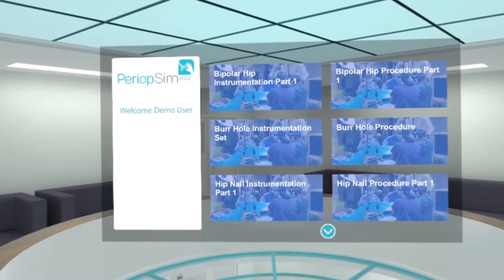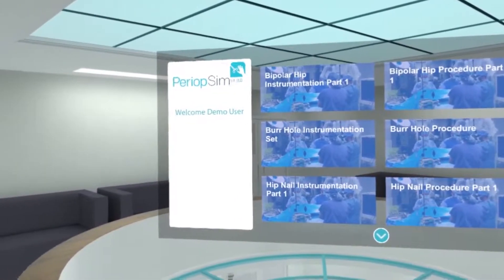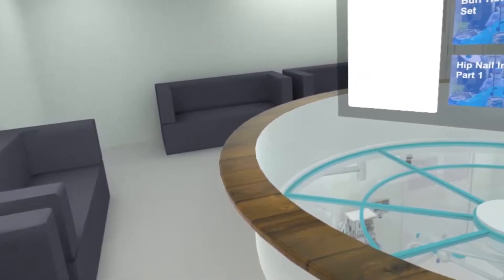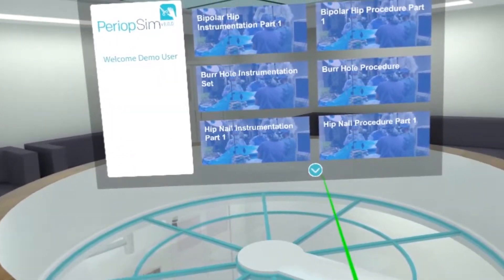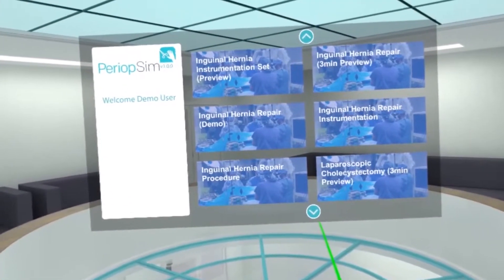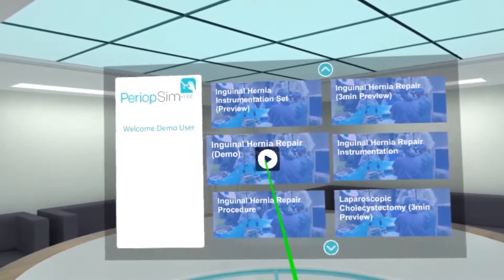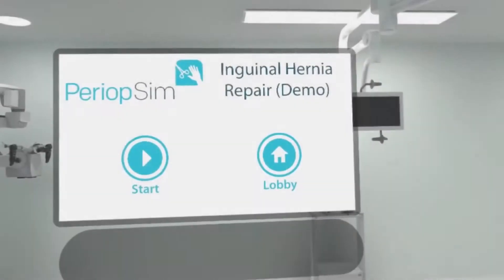Hello and welcome to our PeriopSim VR demo. Where we are right now is in the lobby, and we're able to scroll through and select different modules. What I'm going to do here is go over and do the inguinal hernia repair preview module.